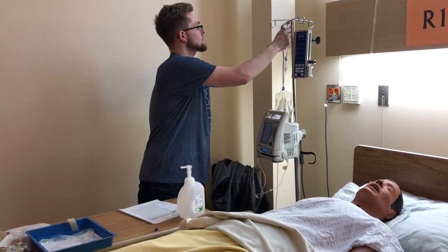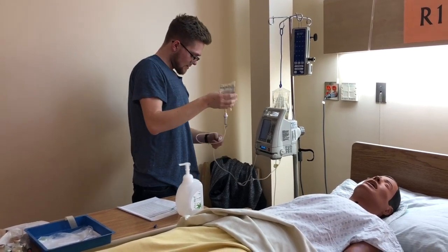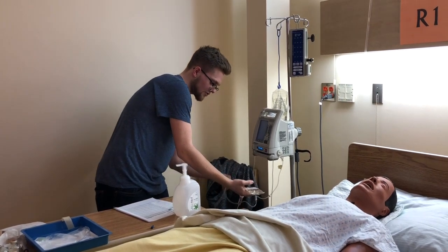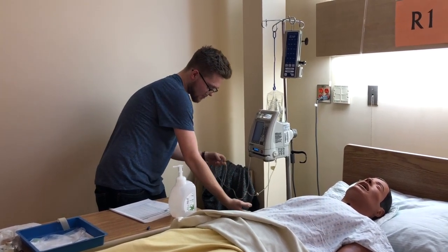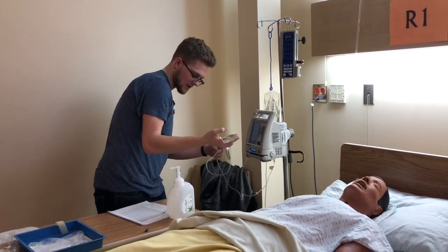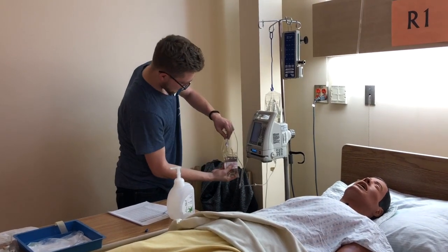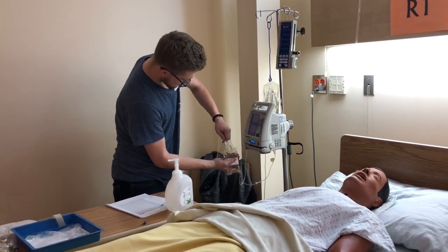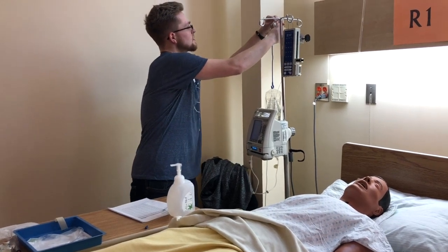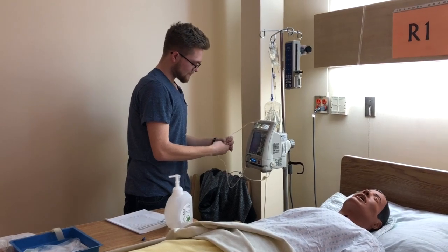So we're going to take this down, open up the clamp, just want to see, so we can see that there's air returning there. There's going to be fluid filling up the drip chamber. Probably going to have to get rid of some of that. So you want to make sure that all the air is evacuating out of the tubing there. There's no kinks in the tubing at all. Okay, so I'm just going to get rid of some of that excess fluid. Have that. All right. Now we'll be setting it up here. I'm just going to put that clamp on again before I start the infusion.